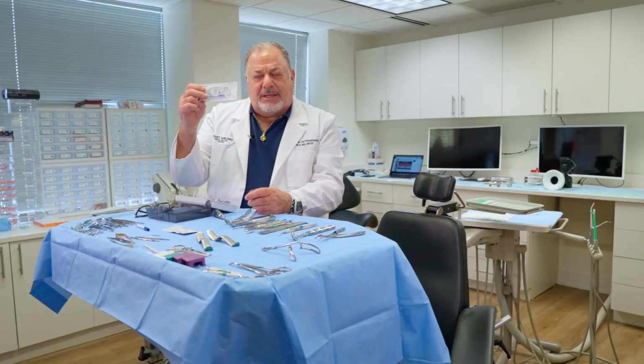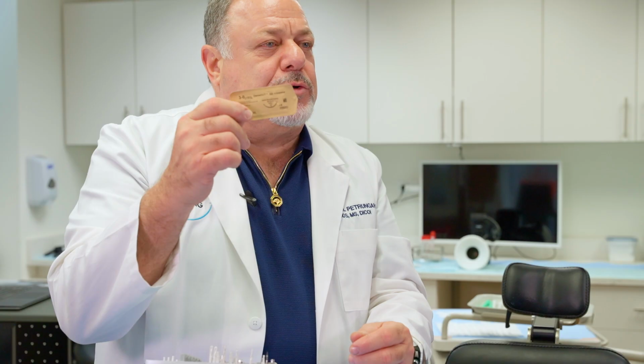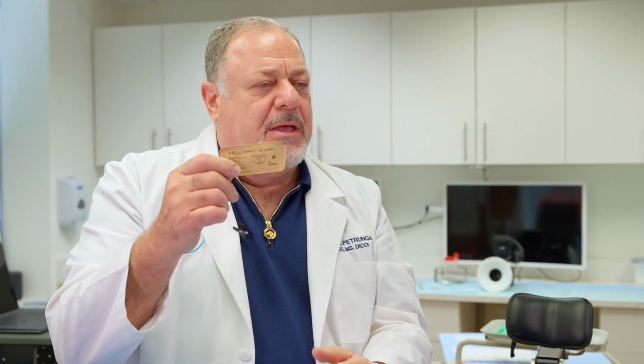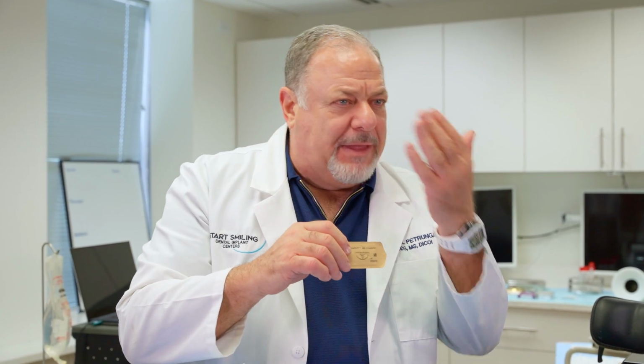You'll be doing that in the three teeth across the front. And then you'll need a 3.0 gut, which will be put up into the vestibular space for the periosteal tack to keep the tissue so that when a patient moves their lip, nothing is going to move with the flap across the front. Okay, so those are the three types of tissue suturing material you'll need for this particular case.